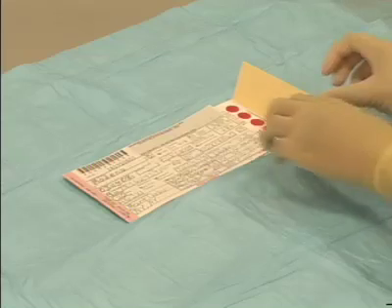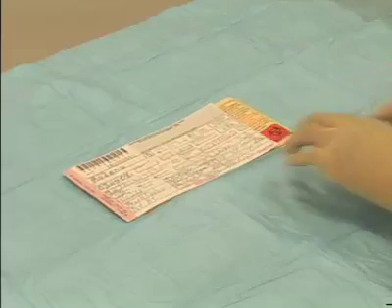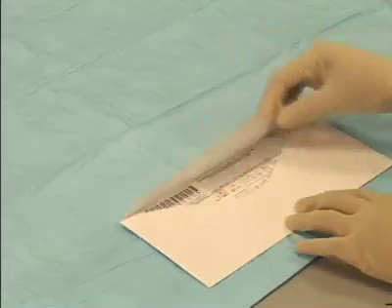Remember to wash or sanitize your hands after removing gloves. Correctly complete all the information on the screening card so that follow-up can be done if the results are abnormal. The screening card should be placed in an appropriate envelope and sent to the specified testing laboratory within 24 hours.